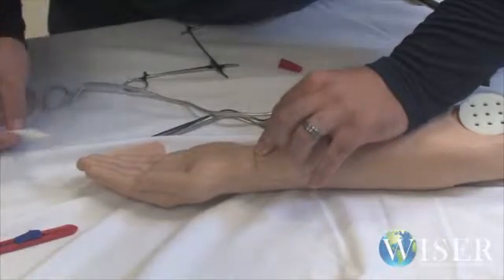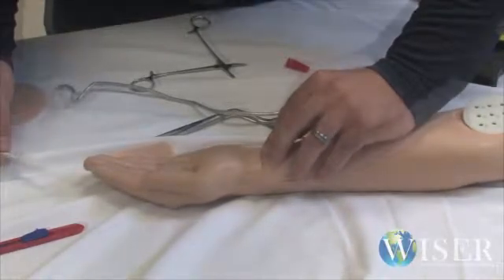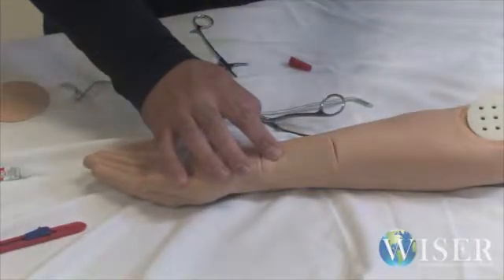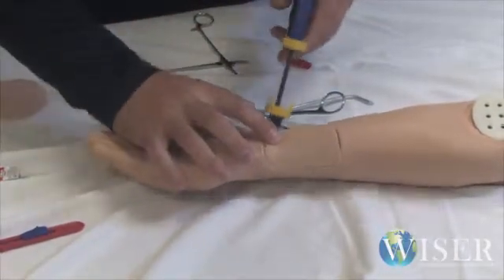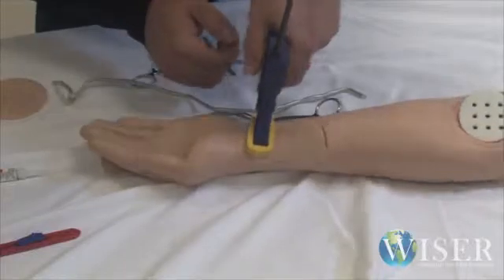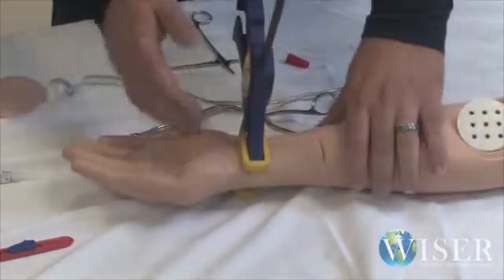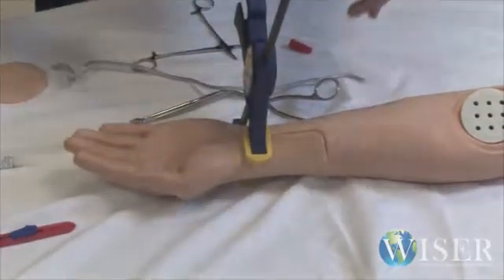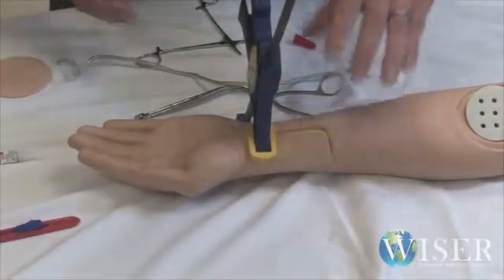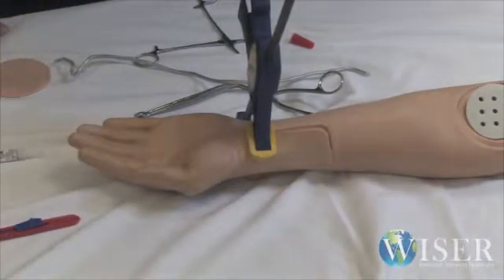and hold it. And it takes a second to bond. Sometimes I'll even use a clamp. And this is a process, so you can take breaks, make sure the glue bonds, and then start on the other side. And take your time and make sure everything bonds properly and that it looks clean and back to what it was when you started.